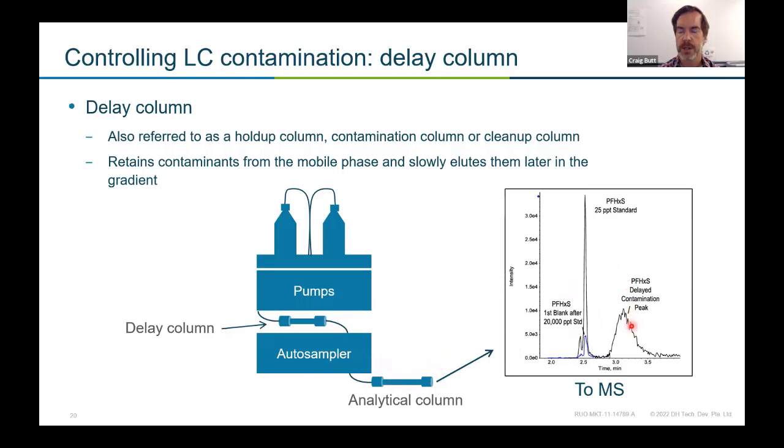And you can see here just an example. This big hump here was what was delayed from the pumps of the LC system. And if we didn't do that, then that would have resulted in much higher detection limits. So again, not just for drinking water analysis, but any PFAS analysis, it's important to control the contamination from your LC system.